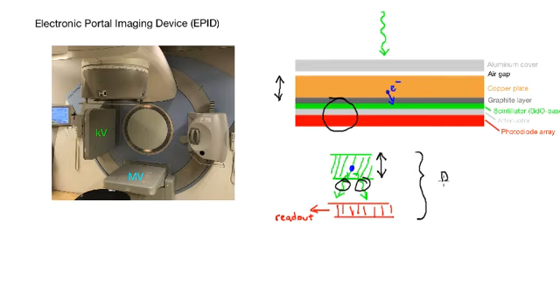Overall, this is called the detective quantum efficiency of the system, DQE. Essentially, how much signal comes out. I talked about one way to influence that. You can make the collection conversion layer thicker, okay? But there are disadvantages to that as well. So a thicker area, you're spreading out the collection area over a bigger range, and so that essentially blurs out the image, makes the resolution lower.